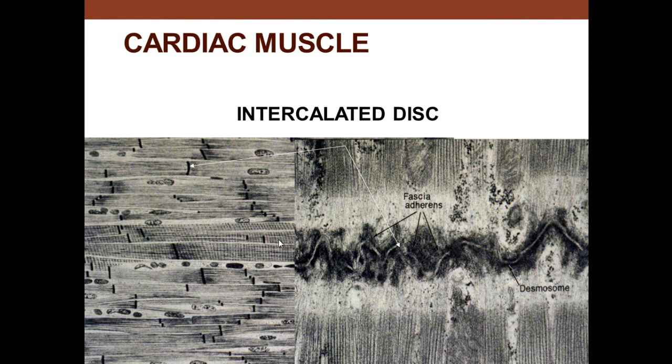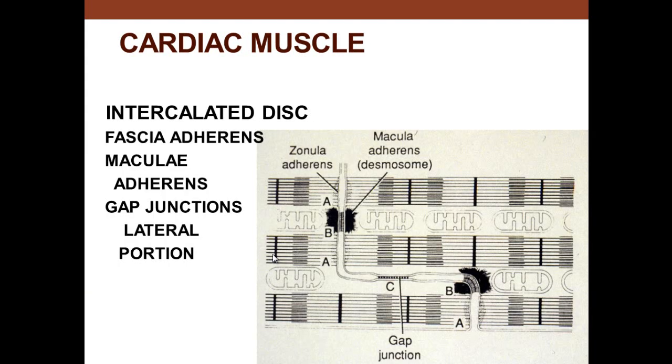In the muscle cell itself, we can see the intercalated disc. That is where one cell attaches to another one. Usually on the lateral side, there are gap junctions where it can communicate from one to another. So the major striations here are the intercalated discs, where one cell joins to another. The cardiac cells could be branched, but you also see the periodicity here, which is the A and I bands associated with muscle, striated muscle.